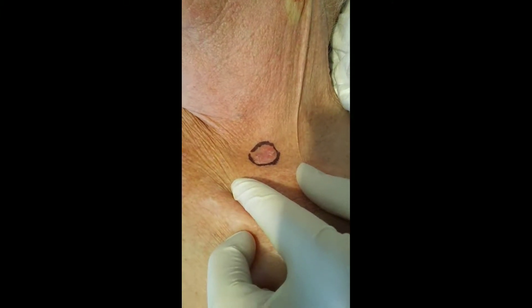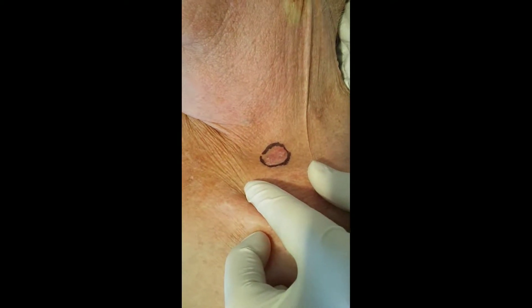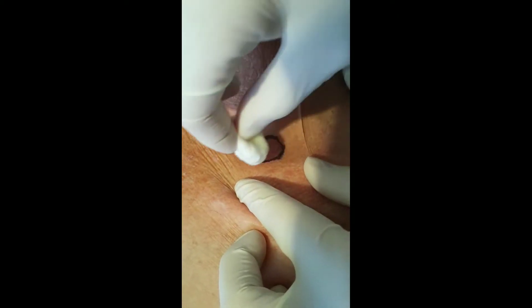Here we're looking at a skin lesion which is probably Bowen's disease, which is squamous cell carcinoma in situ. What we're going to do is punch biopsy the lesion. To do that, first of all we'll clean the area.